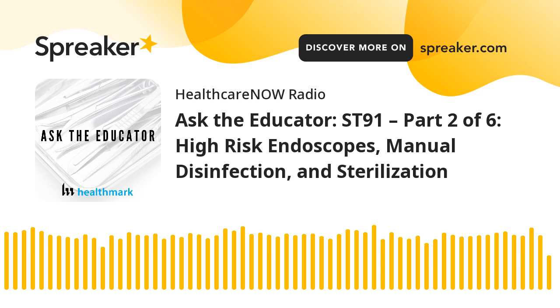Yeah, Adam, I have a whole presentation on that topic itself, but I'm going to try to streamline it to a minute or two here because I'm very passionate about getting the industry to move to sterilization. As a working group, we felt all scopes should move to sterilization, but we understand that we can't do that today. So how can we get the industry to move towards sterilization over the next couple of years? We did that by reaffirming what the original Spaulding classification said: that semi-critical devices, which are our flexible endoscopes, at minimum should be cleaned and sterilized. Not high-level disinfected, sterilized, which is what it originally said.